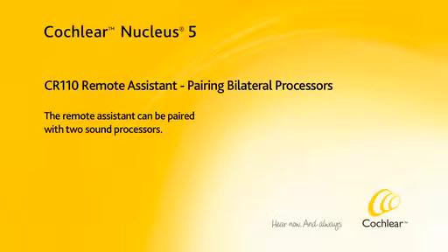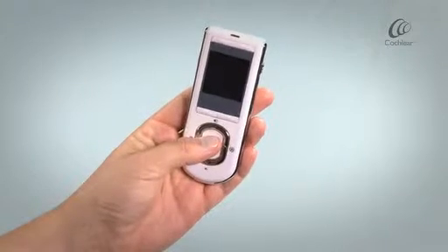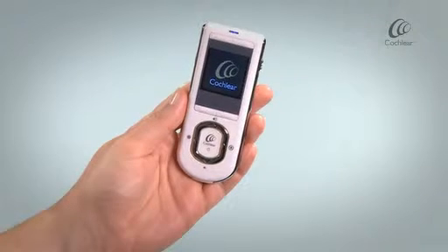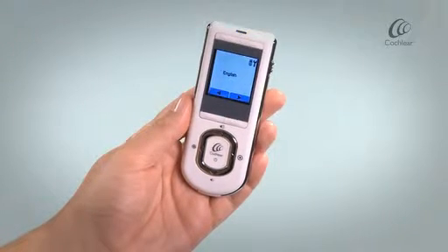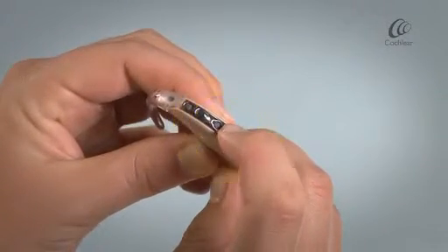The remote assistant can be paired with two sound processors. First, turn on your remote assistant. Press and hold the lower button on your processor to turn it on.